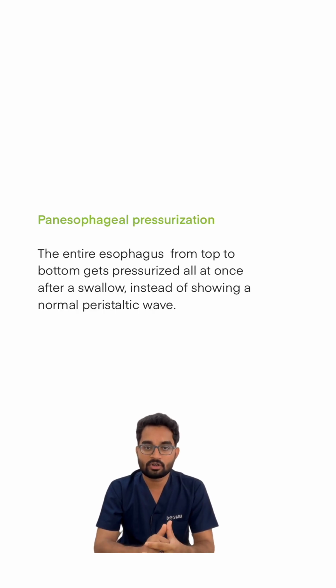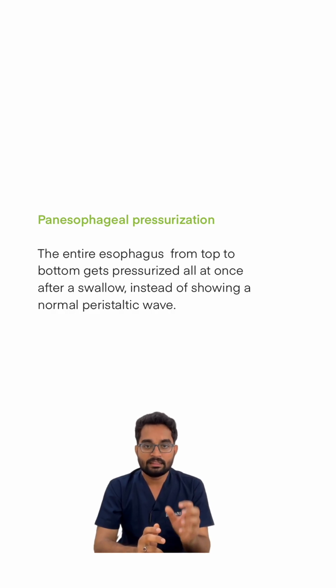There is one more terminology called pan-esophageal pressurization. This means instead of a peristaltic wave, the entire length of the esophagus is contracting at a single point of time. This is nothing but pan-esophageal pressurization.